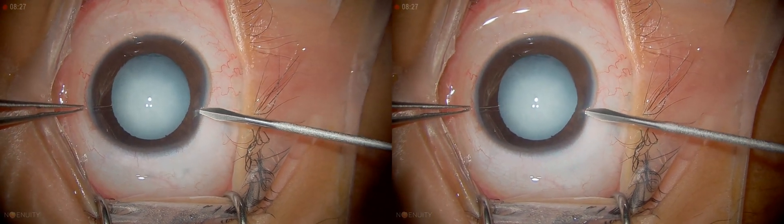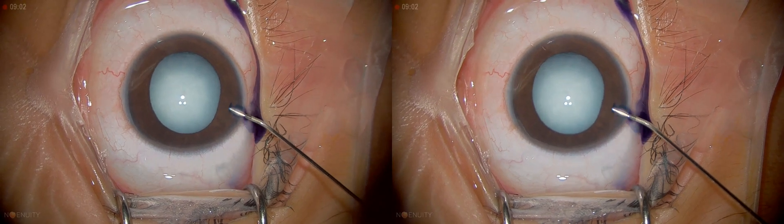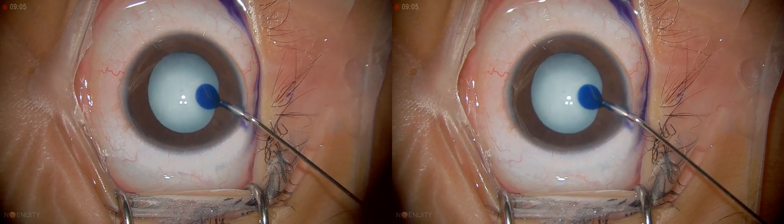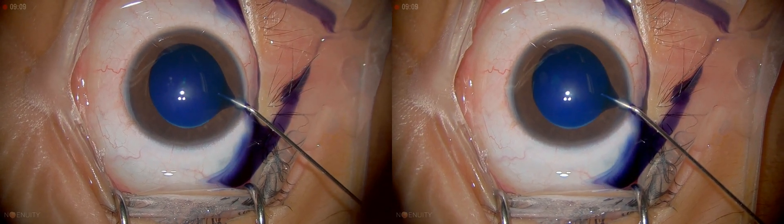You can see the cataract is total in both eyes — the lens is totally white. So I'm going to inject viscoelastic and stain the capsule.